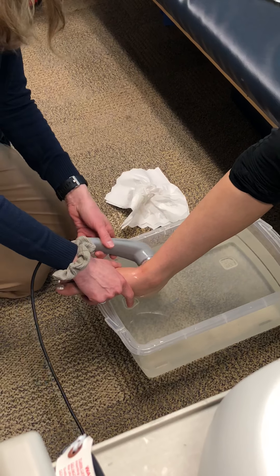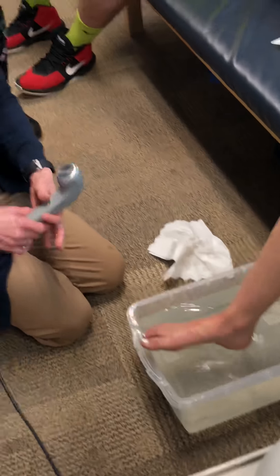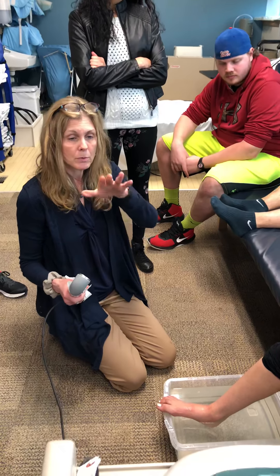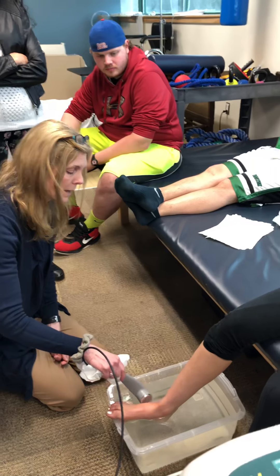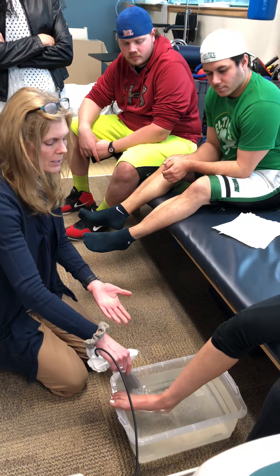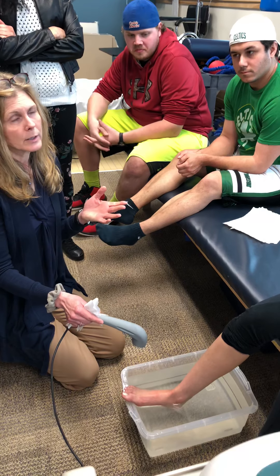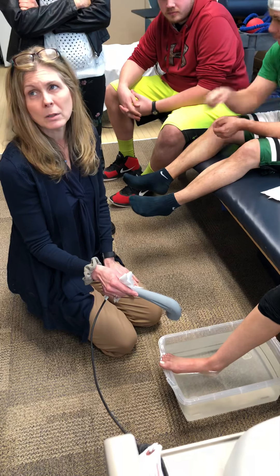There's no way I can make contact here and it's going to hurt her with the bones. So if you're doing a lot of sprained ankles, fingers — it's just another option as long as you remember the parameters are 50% greater. You just don't want half of the sound head out of the water. In this circumstance I don't need to put a glove on because my hand wasn't in the water. If it's something higher on the leg, I may have to put a glove on — the glove is really meant for sterile technique or so you don't get treated by the ultrasound yourself.